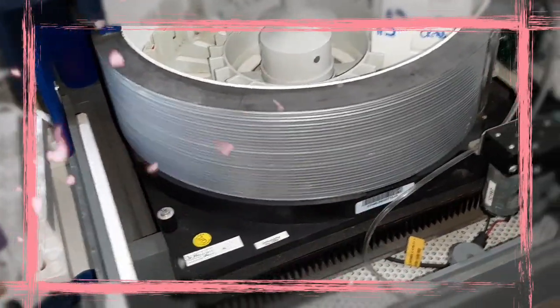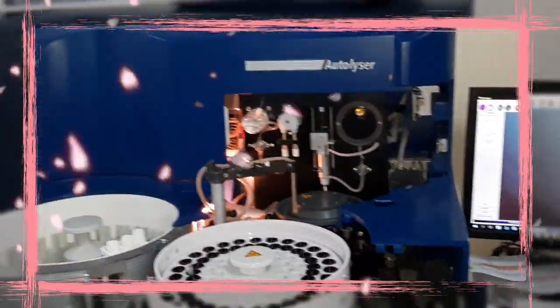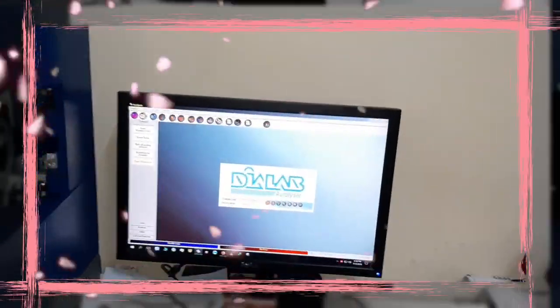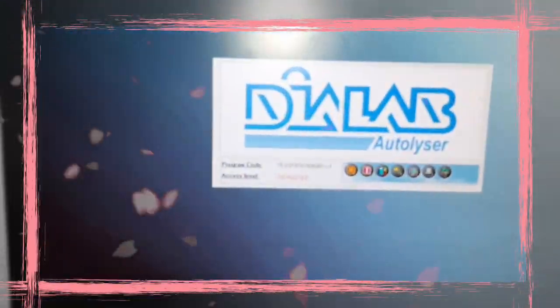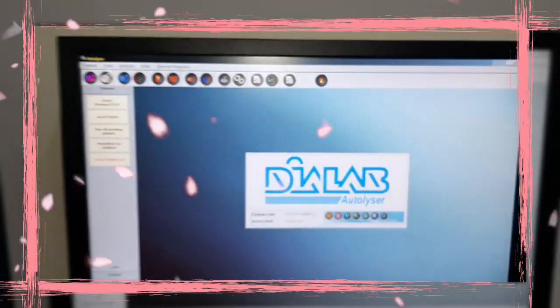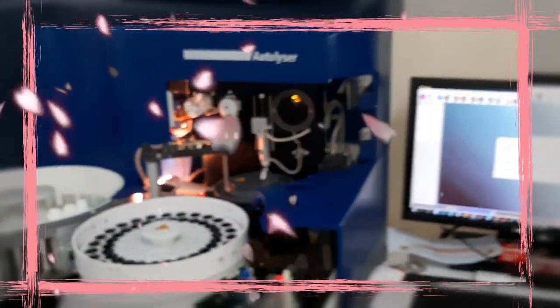So going straight to the specification of this machine, it is actually a clinical chemistry and a turbidimetry analyzer, and it's fully automated. It has dedicated locations for calibrators and standards and then controls, and it has 10 channels of filters for running your tests. It has barcode identification system for both reagents and sample, but this is an optional feature that you can request when you're buying the machine.